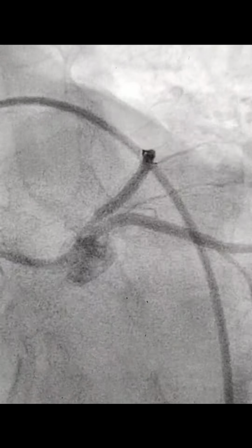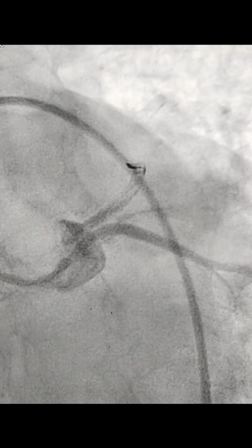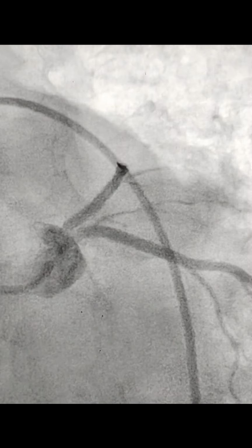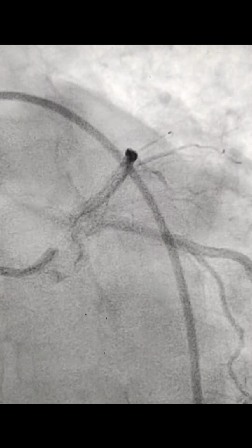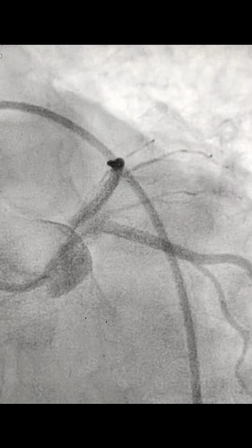So you could see the same view, cranial view, and we have opened the LAD now. This was the angioplasty to LAD, primary angioplasty after 6 to 7 hours of chest pain, and the patient had one episode of VT and then hypotension. But now after opening the artery, it has improved. The BP has come up, and now the patient is stable. So this was the complex primary angioplasty with separate origin of LAD and LCX. There was no LM, left main.